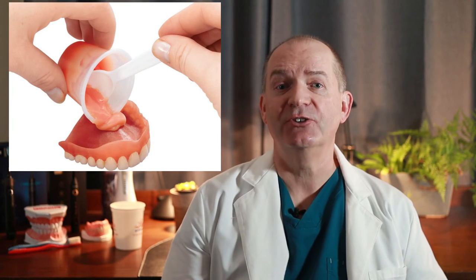Relining the snap-in denture involves adding more plastic to the underside of it. This can either be done in the office or it might need to be done at the dental lab. The snaps inside the denture will usually be reset in the denture after the reline so that they are in the proper position. Again, your gum should hold up the denture. The snaps just hold it in place.